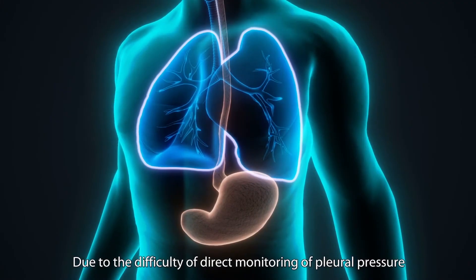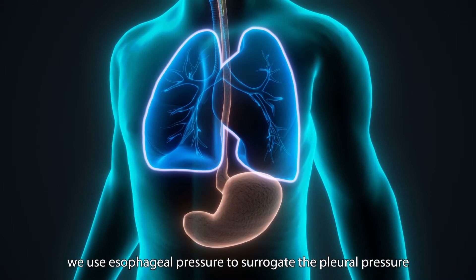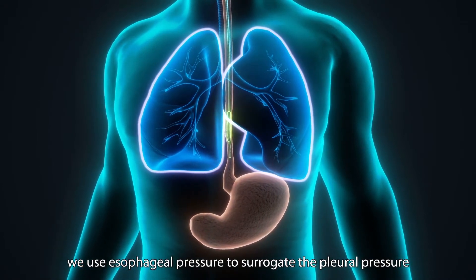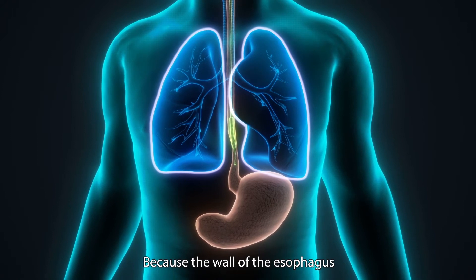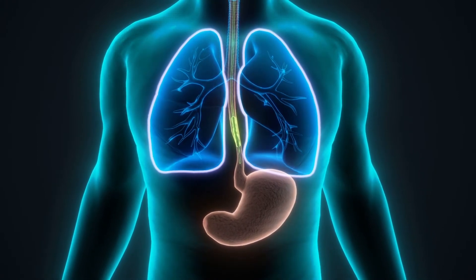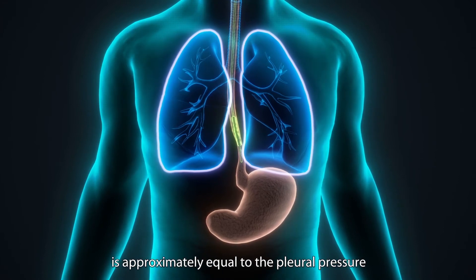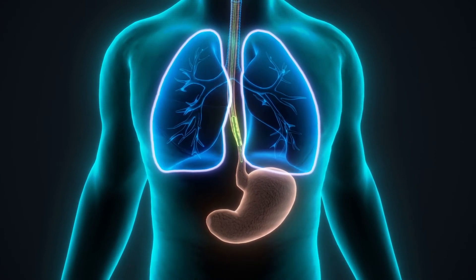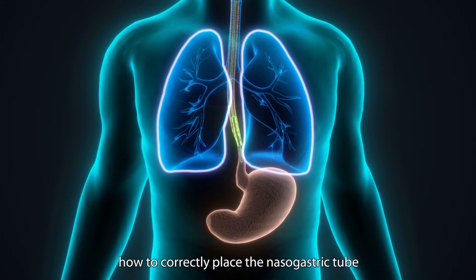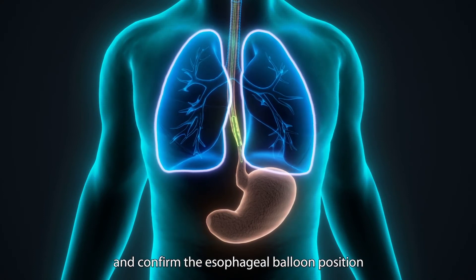Due to the difficulty of direct monitoring of pleural pressure, we use esophageal pressure to surrogate the pleural pressure. Because the wall of the esophagus is closely adhering to the pleural cavity, the pressure of the esophageal wall is approximately equal to the pleural pressure. The following section is to show how to correctly place the nasogastric tube and confirm the esophageal balloon position.